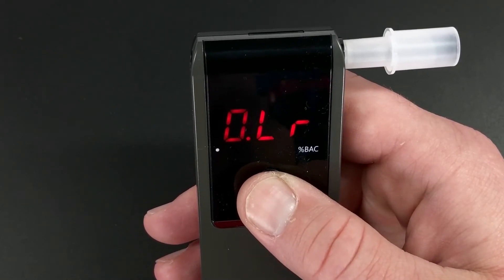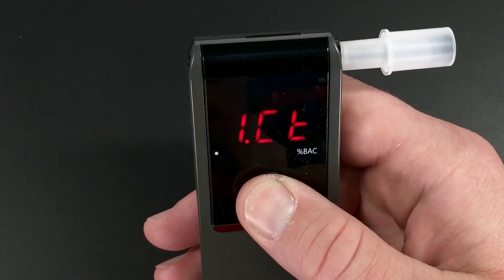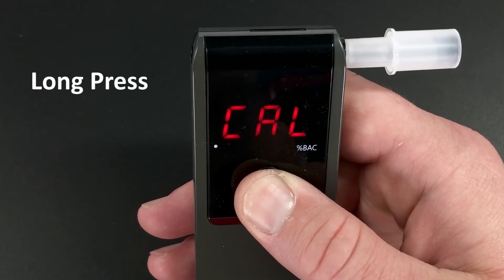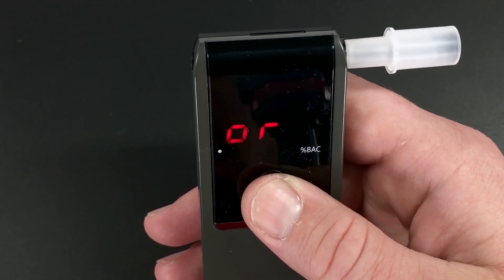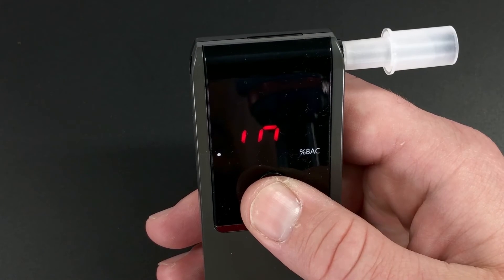To see the number of days and counting to the next calibration, go to the menu and single press until you see 2CD. Long press 2CD. You'll see that in this case, the unit has 419 days or 974 tests until the next calibration.